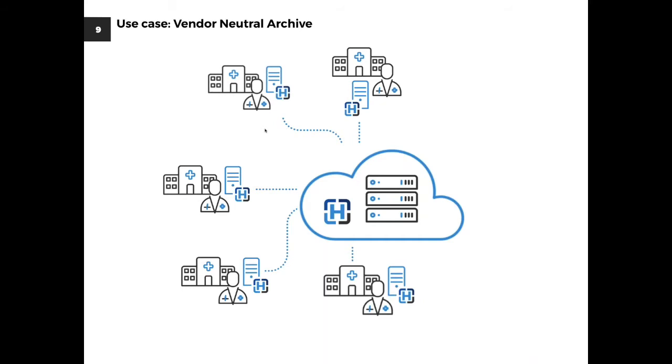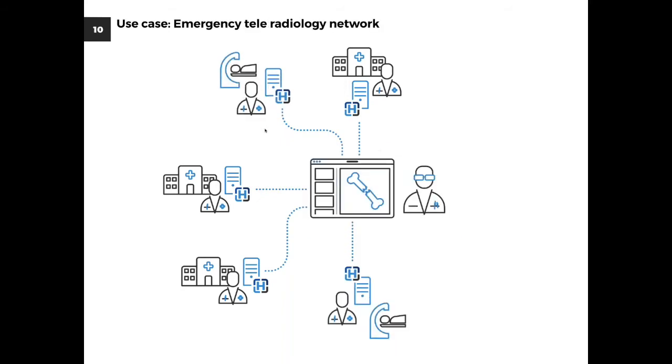This is a vendor-neutral archive solution where multiple hospitals basically store and archive the residue of their storage in a centrally located database.